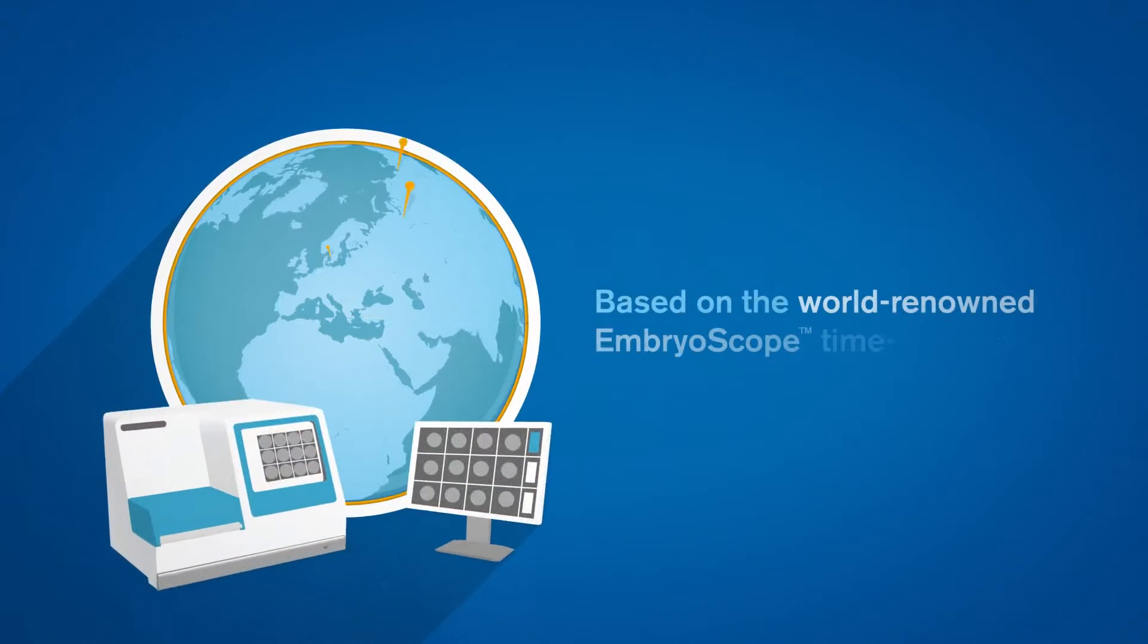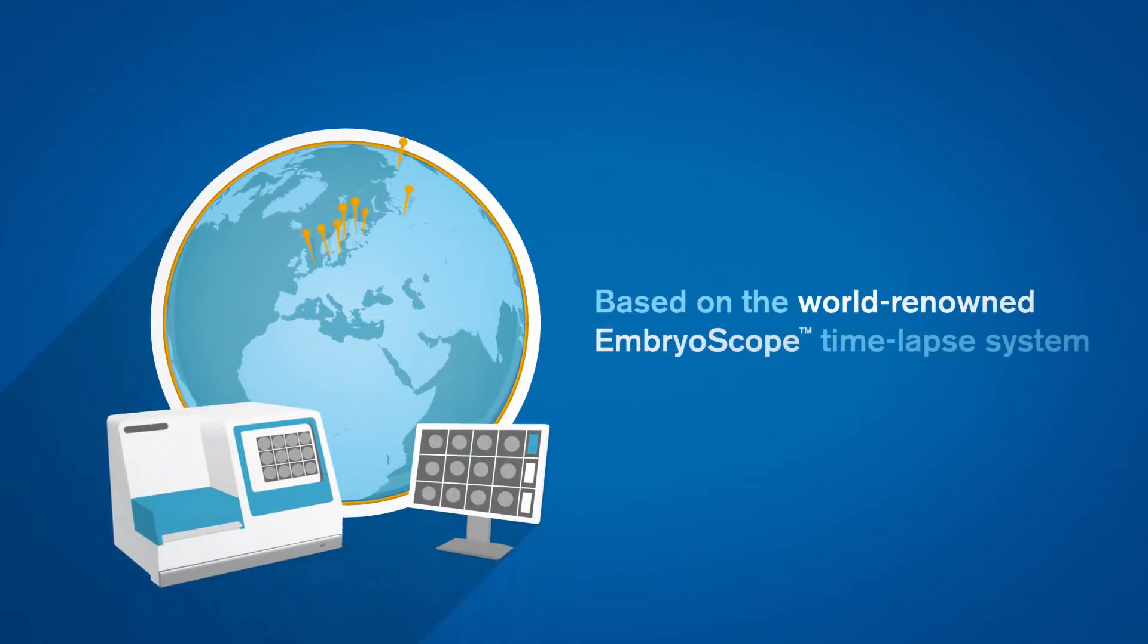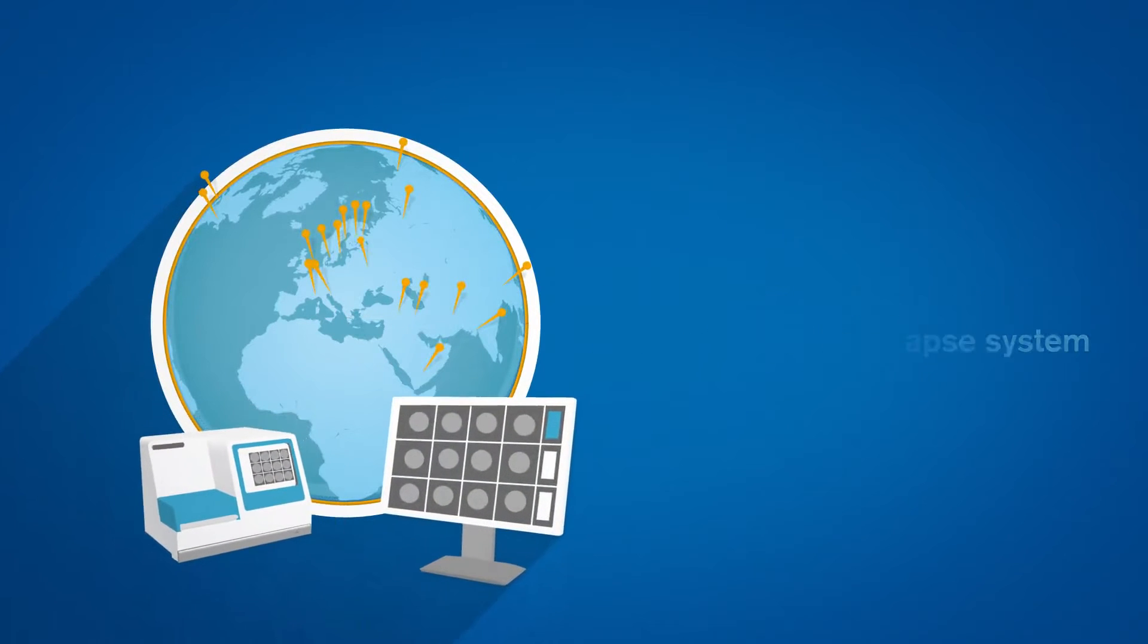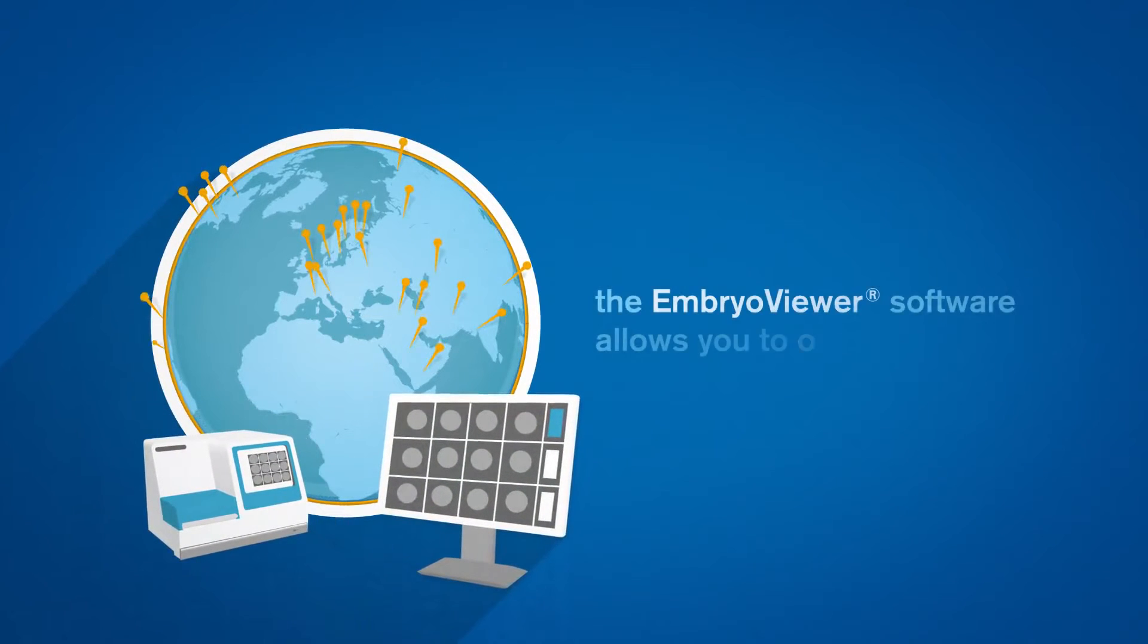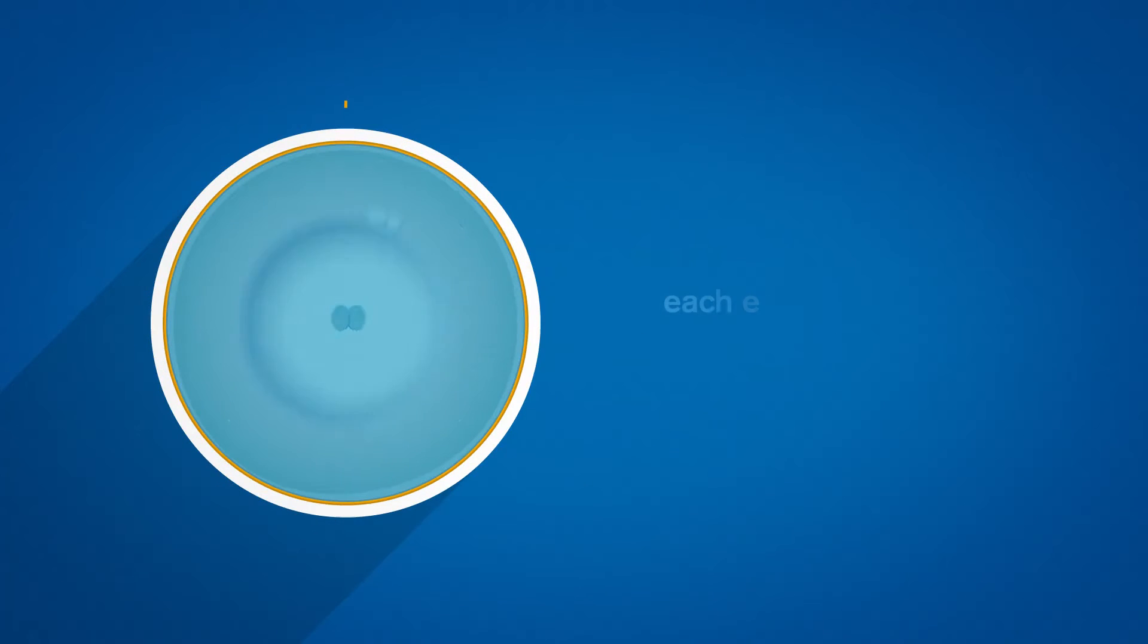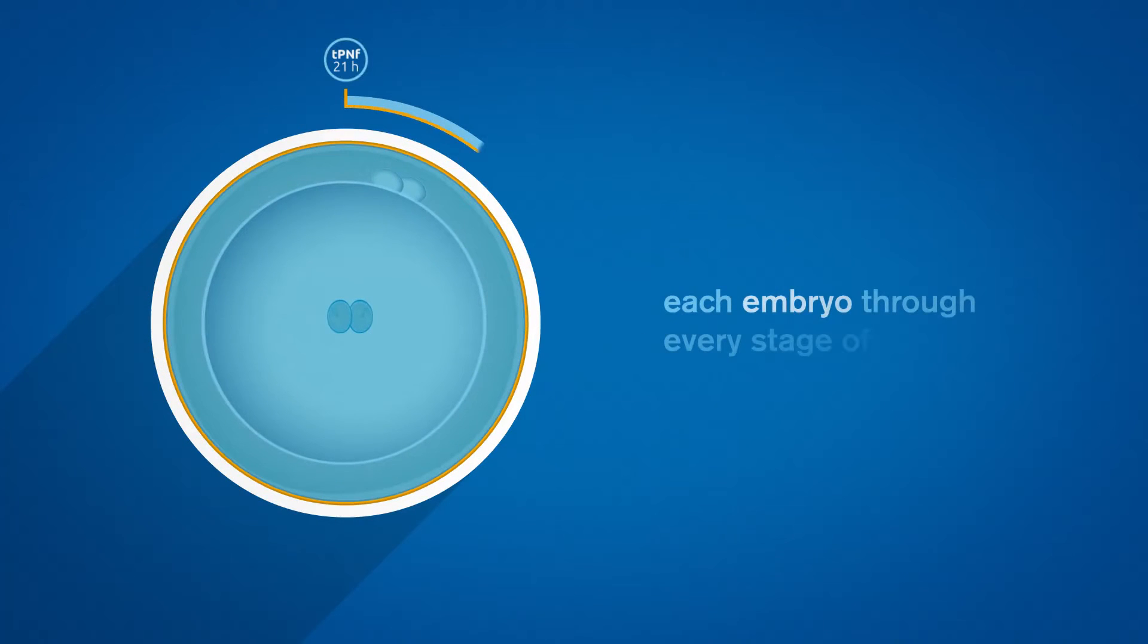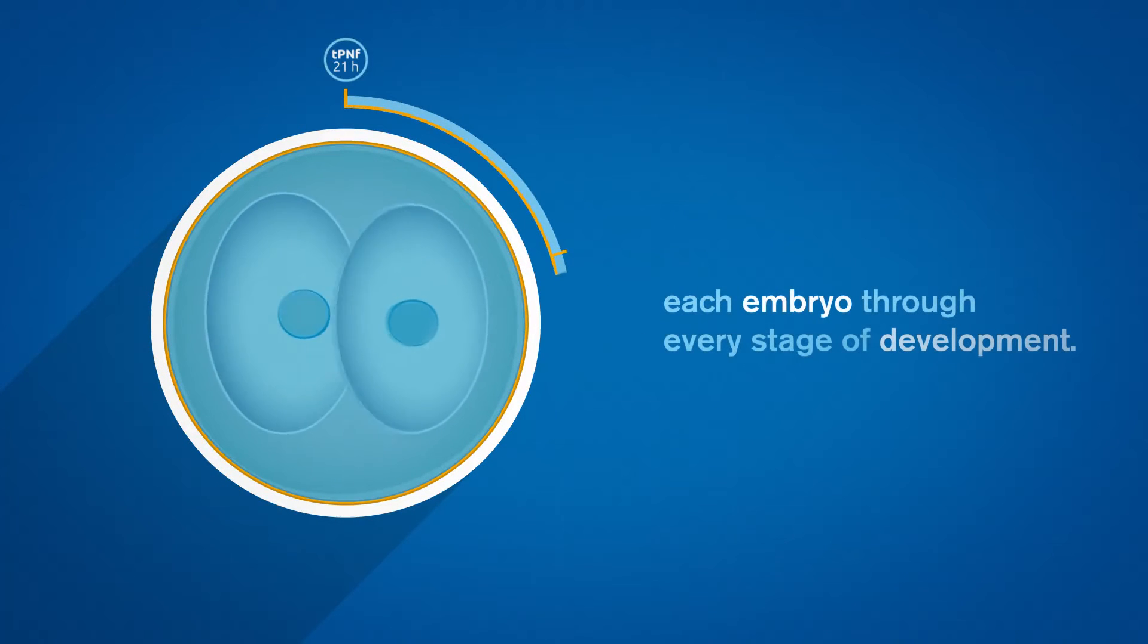Based on the world-renowned Embryoscope time-lapse system, the EmbryoViewer software allows you to observe each embryo through every stage of development.